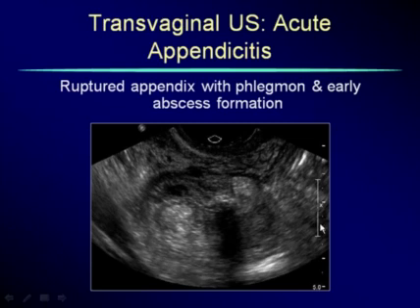We were looking at this area, wondering what's going on. Do we have some kind of abscess happening here? Is it related to the ovary or not? We realized that it was separate. It's always very helpful when little arrows come up to show us things, like the echogenic focus that shadows, which is the appendicolith. And then this actually, as we scanned around, was the limits of this mass. This is already pus and an abscess that has formed at the tip of this perforated appendix.